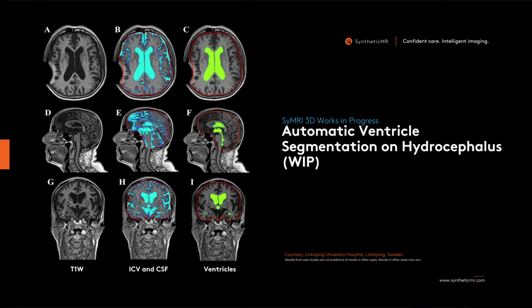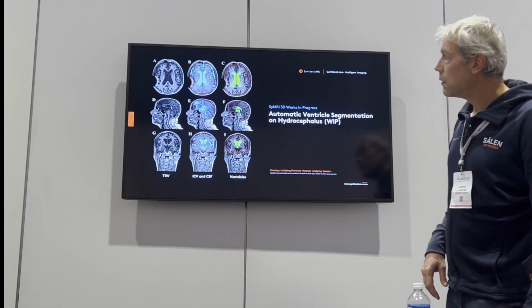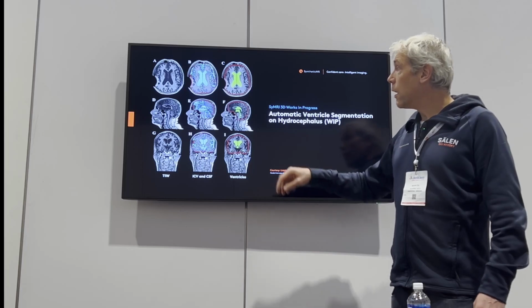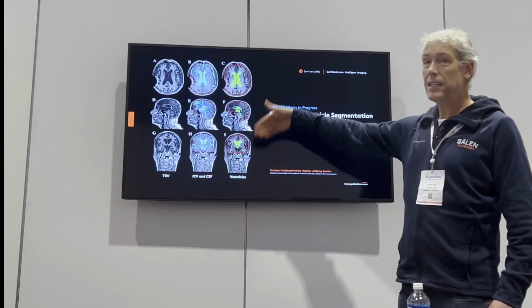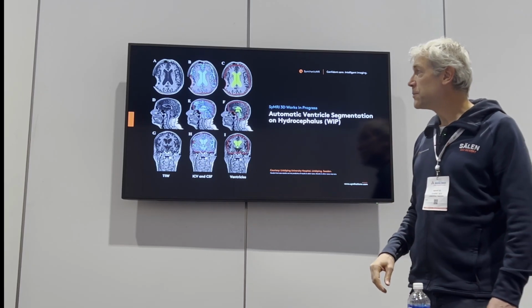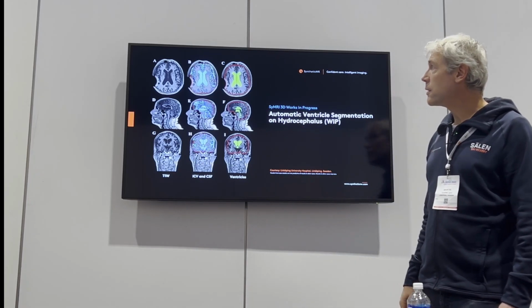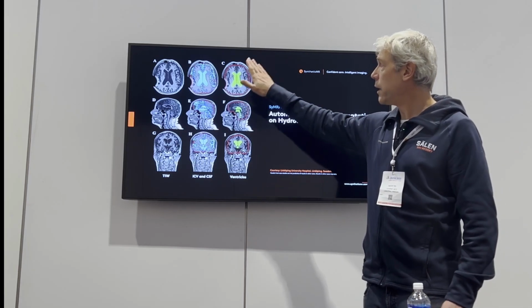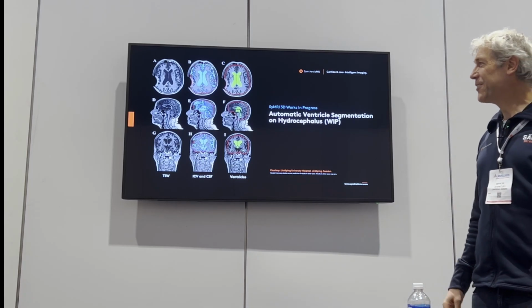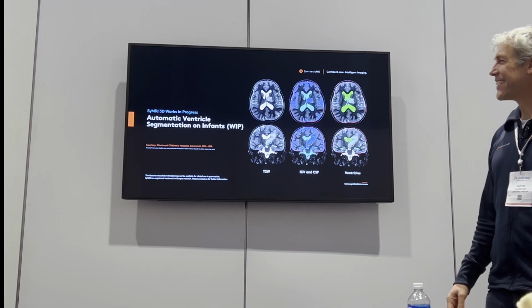CSF. This part you mean? Actually, there's a membrane over there. So this is exactly the mid slice, and so it's wrapping around that. So no, it's not missing. It's actually there, but it's on both sides. It just happened to be the fissure there. I guess you can see it here. It's a bit higher up in the brain that both parts are there. Don't worry. Let's go to the next.